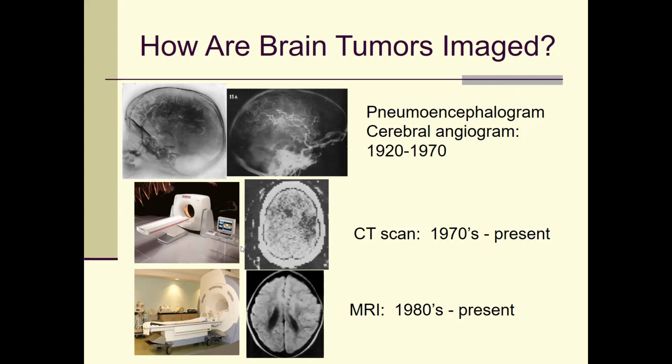Then the CAT scan arrived, able to see inside the brain. So this is the first generation of the CAT scan, which is very primitive in look, but eventually, from the very beginning of the skull and the surrounding structures, you can see the inside brain structures.